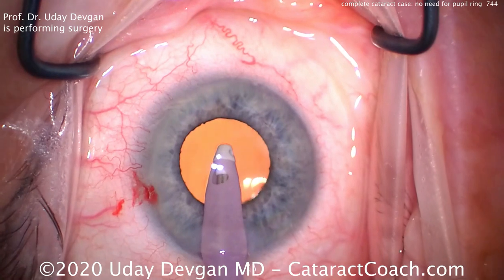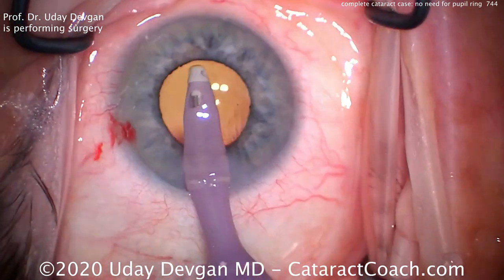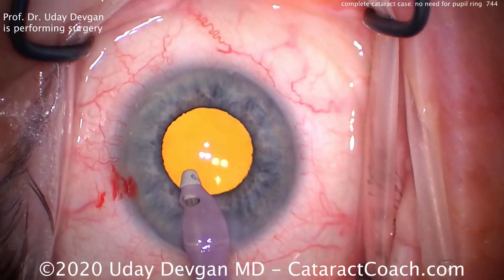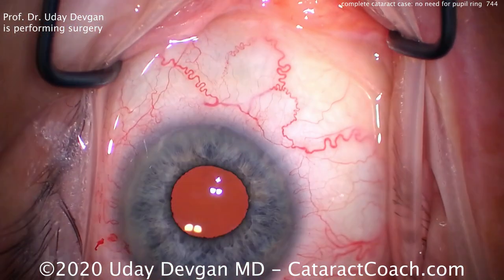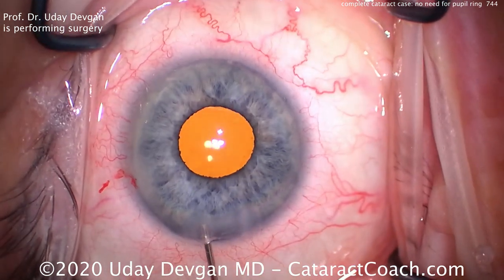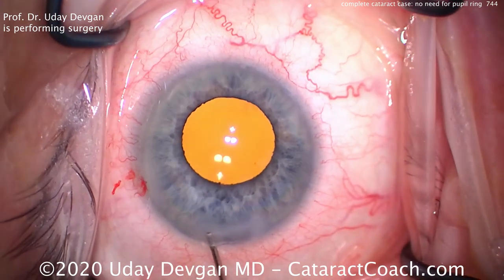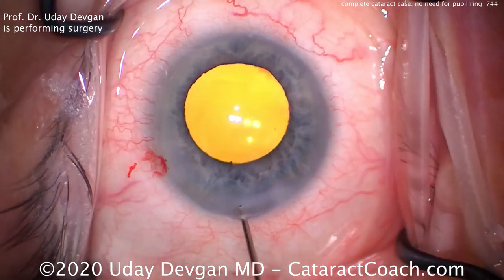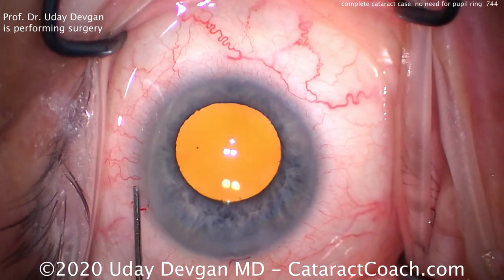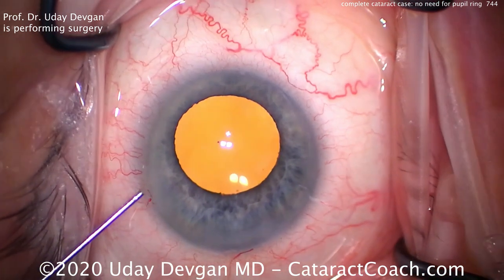Finishing up the case here, looks pretty good. Now you see the pupil really has come down. And when we take out the infusion from this IA probe, you'll notice the pupil come down even more — because with the infusion probe in the eye, the IOP is very high; 40 to 50 millimeters of mercury is very typical. Hydrate the incision nice and easy. Now let's go in through the side port and hydrate that — we can also sweep to make sure there's no retained viscoelastic.